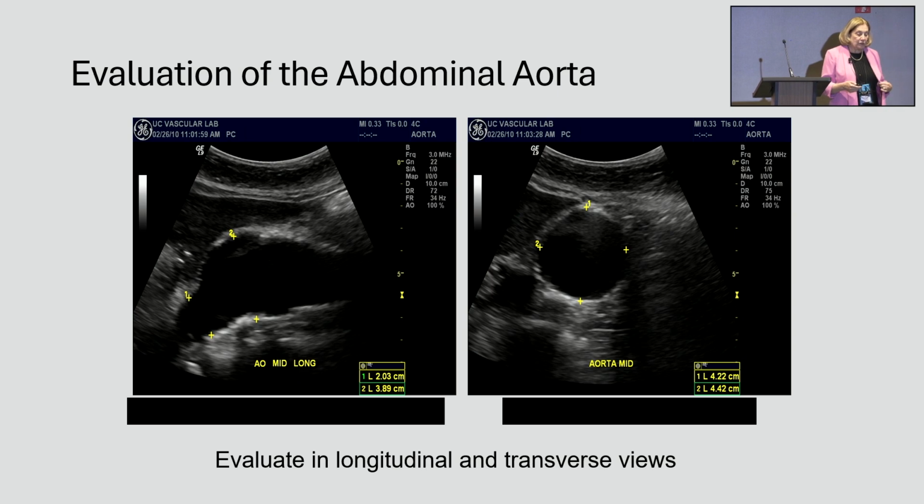Okay, and another one, just again, different examples. This one actually has some plaque on one wall, and again, where you place those cursors matters. I encourage you, even in a lab where you say, well, we're all experienced, we know what we're doing, it's just measuring the circle, to sometimes, at your quality meetings or comparison meetings, pull these images out and ask, where would you have put your cursors? Sometimes you find, especially with newer and less experienced people, but even among experienced people, that the cursor placement differs.